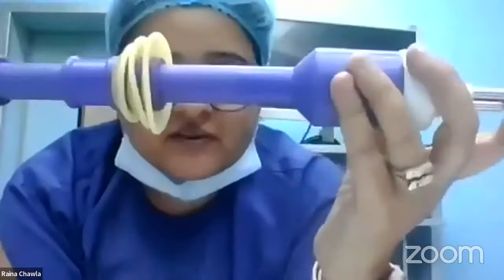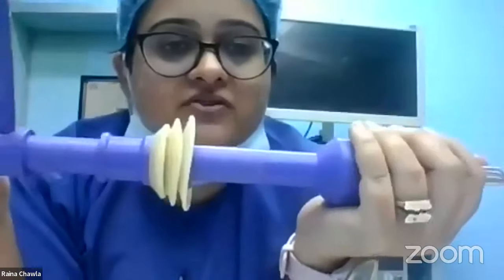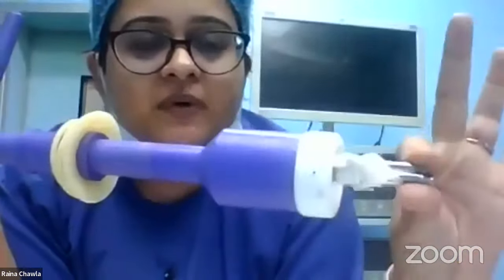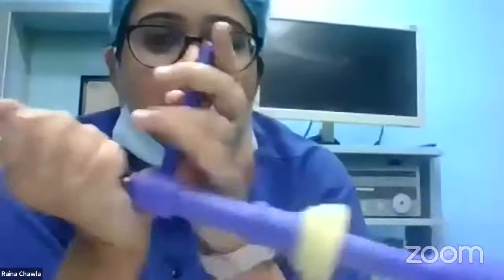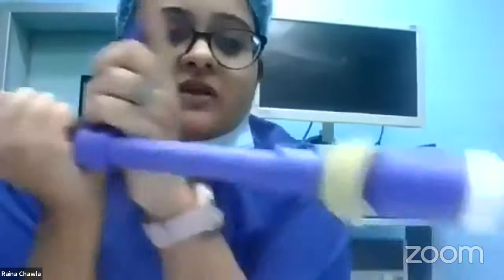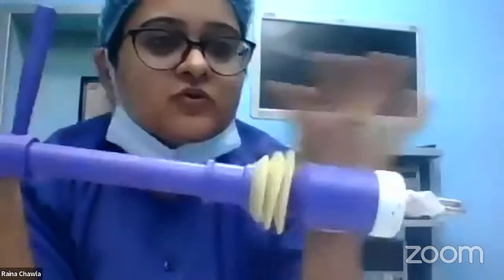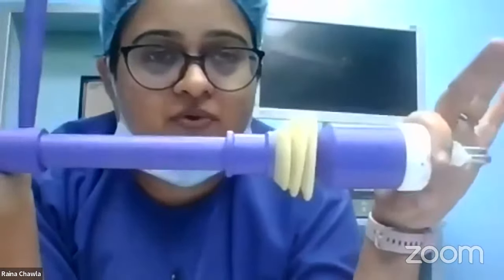Remember, when we are doing laparoscopic hysterectomy, we use this instrument, we introduce it from the vagina. This part goes inside the uterus and using this, we manipulate the uterus. We can move the uterus in whatever direction we want, to the left, the right, up and down. And this improves the visualization during laparoscopy.